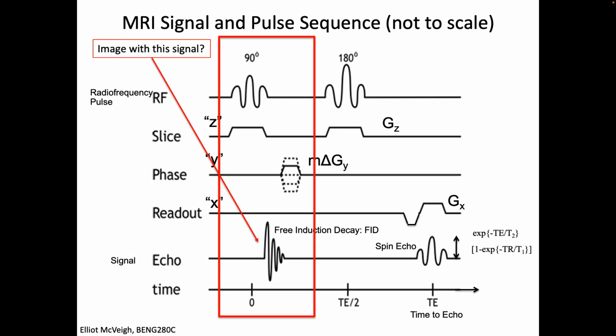And I went through this. One of my postdocs, who's now a big deal in Turkey, Ergen Adalar, was in the scanner, and he said, oh, I felt stimulation. So I changed the switching rate such that it changed that delta by literally a microsecond. It made it longer. And then I pushed and I said, did you feel it then? He said, no, I didn't feel it. And then I changed it back to a microsecond shorter, and I pushed and he said, oh yeah, I felt it, right? And I said, no, this is crazy.